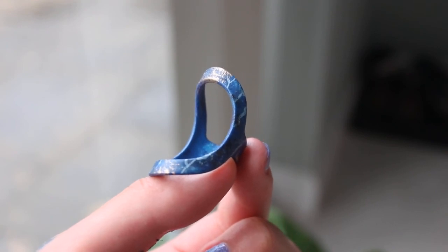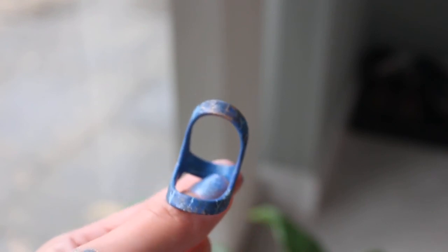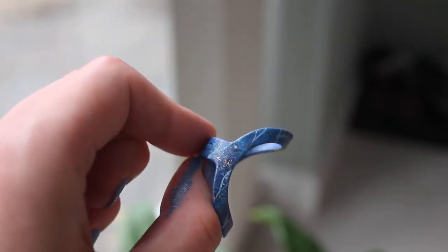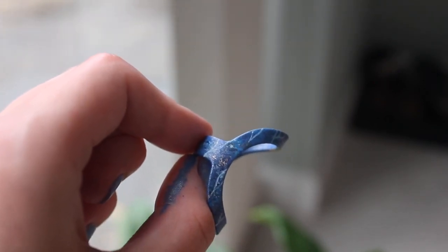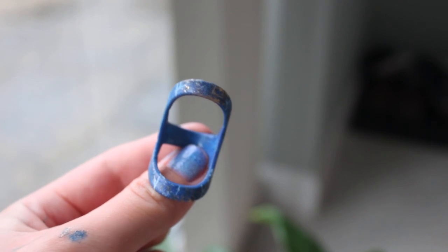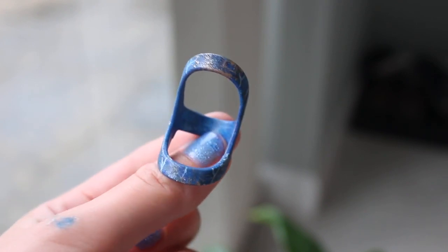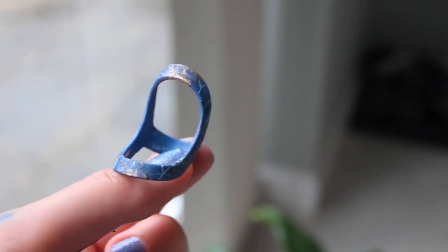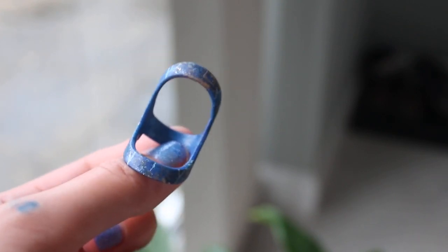This is the finished ring splint with the gold touches added. Now the final step is to coat them with a clear varnish to protect the paintwork.